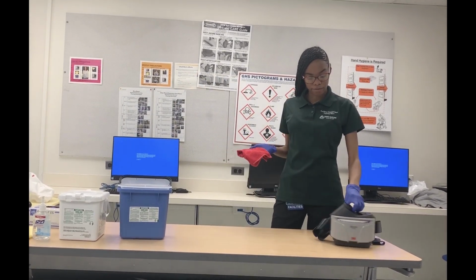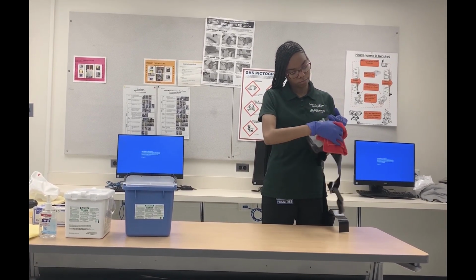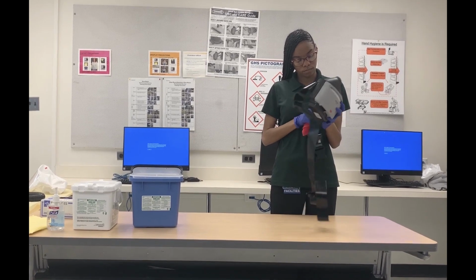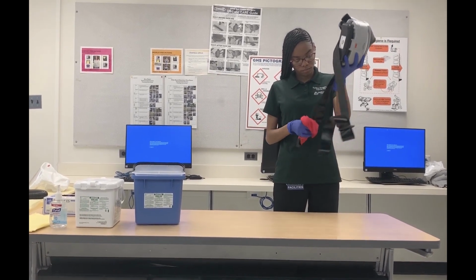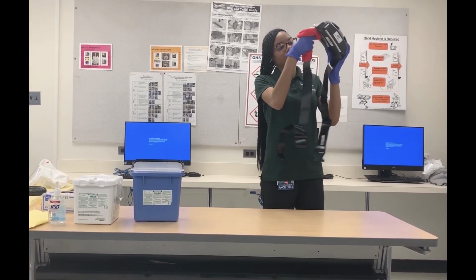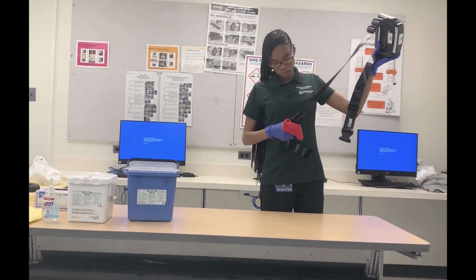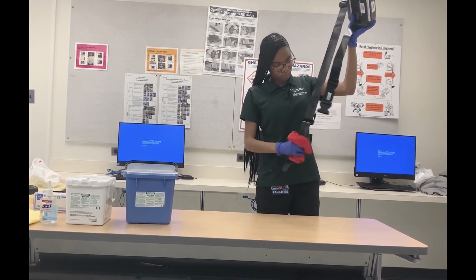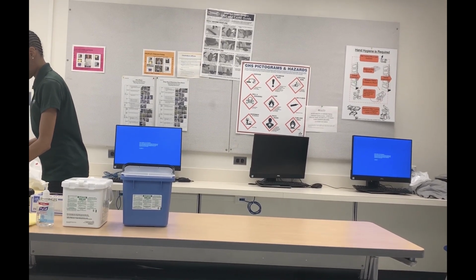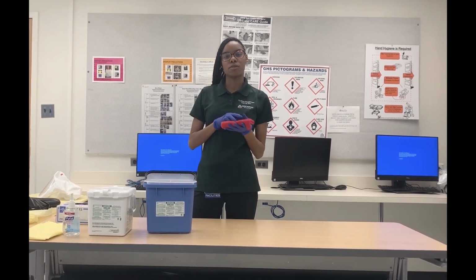Using the opposite side to clean your battery pack. Moving from your dirty side also to your clean side. With your red rag, you're going to then discard your red rag into your linen chute, into your blue bag with your linen.